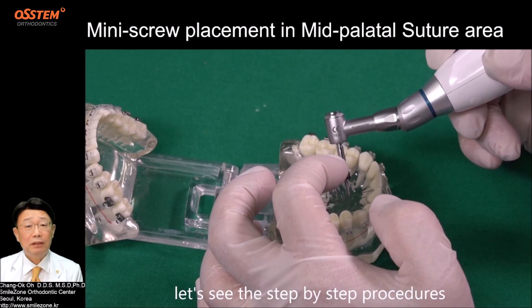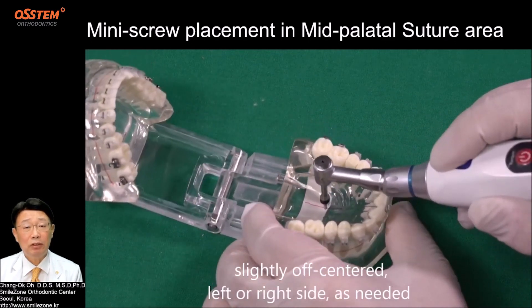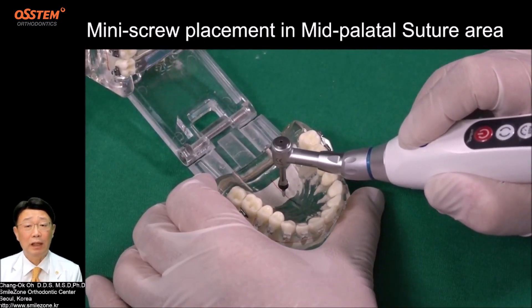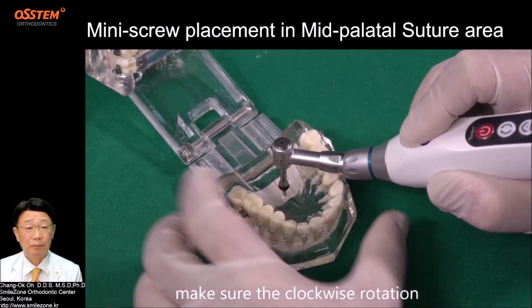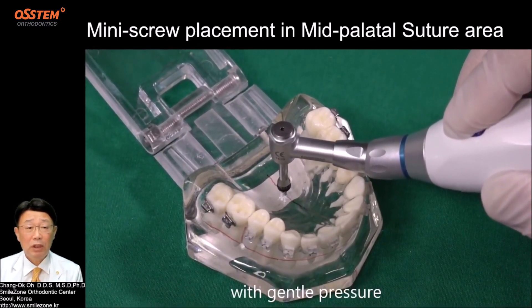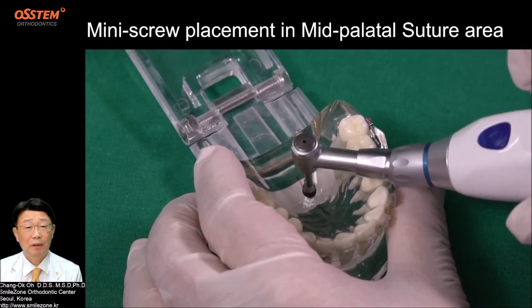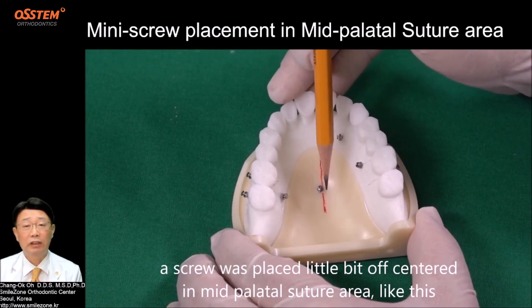Let's see the step-by-step procedures. With the mid-size length shaft and a 1.6 mm, 6 mm screw slightly off-centered — left or right side as needed — set the passive insertion perpendicular to the occlusal plane. Then press the button to start insertion, making sure of clockwise rotation. With gentle pressure, keep the path straight until the collar of the screw touches the soft tissue surface. A screw was placed a little bit off-centered in the mid-palatal suture area.